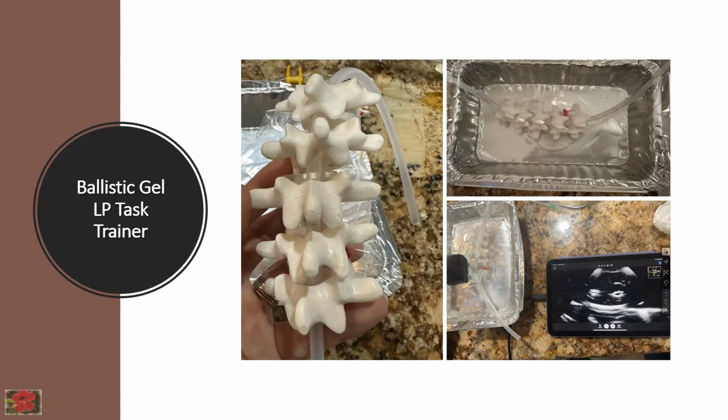You can also, there is a decent amount of latex tubing that is ultrasoundable that I just get at Home Depot if I want some things that are a little bit larger, or if I want it to be a defined space that I can then put a catheter through, and I want to make sure that that space holds its structure for a long time. Sometimes I'll use latex tubing for those things, but usually I don't use one and then the other. It just depends on what model I'm making and how big I want the vessel to be.